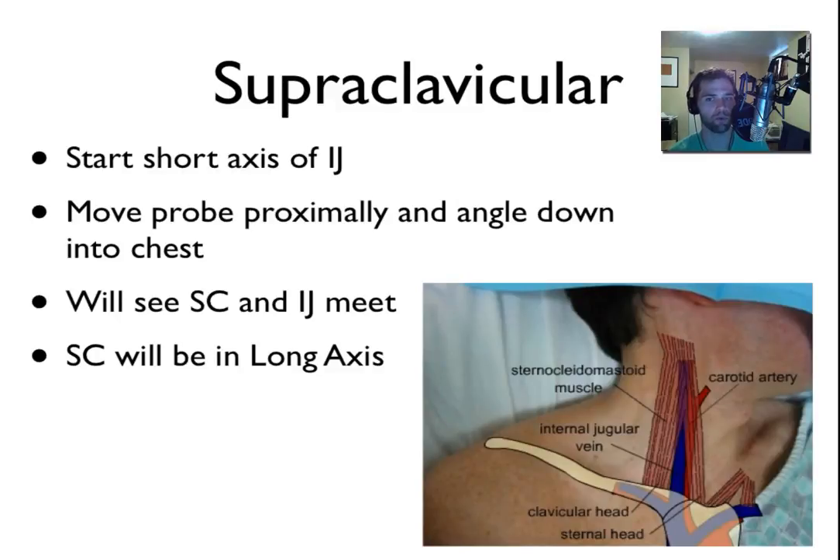The supraclavicular technique can be performed by first placing the probe on the patient's IJ. You basically start looking at the IJ as if you're about to perform an IJ, but instead you start moving the probe proximally, or down towards the chest, and angle the probe down into the patient's chest. What you'll see is the subclavian and the IJ sort of meet at a fairly sharp angle, and then you can often see the brachiocephalic move directly away from the probe, down into the patient's chest. When you look at the IJ in short axis, you'll actually see the subclavian in long axis.